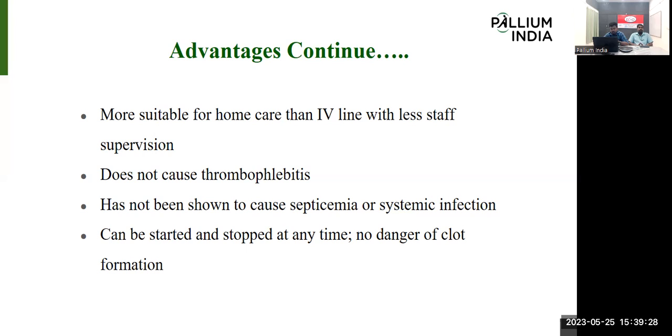So in that team, when deciding to give a sub-Q injection or subcutaneous infusion for the patient, they decided to start right away. Only one staff, not getting any support from co-workers. So if IV cannulation is needed, it is a little bit tough for the staff.